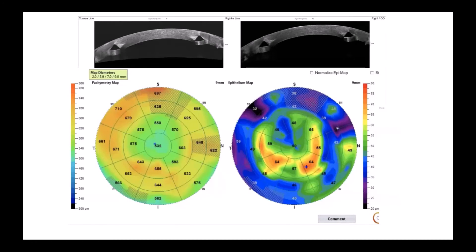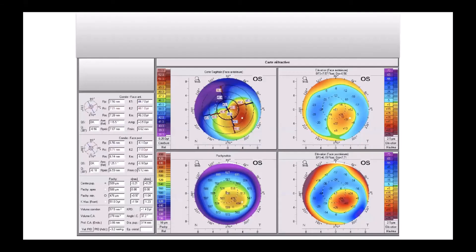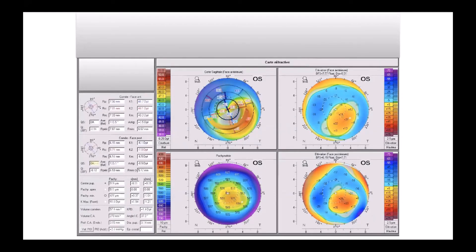This is the OCT. As you see, this is a very interesting epithelium map — the epithelium thickness is more important in the inferior part of the cornea in front of the thinnest part of the ring.